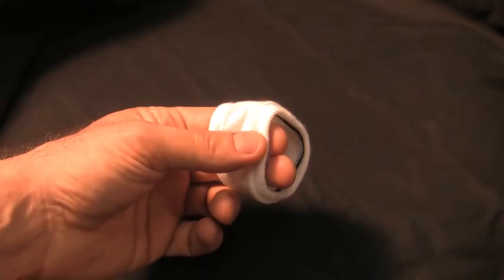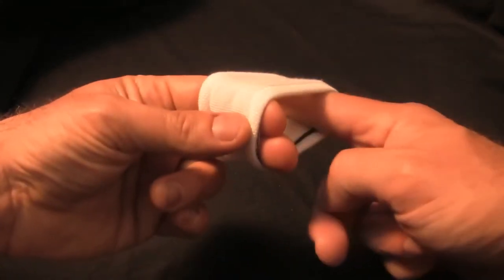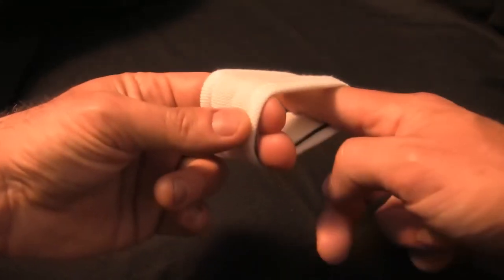When you first get your Snugs, or when it comes out of the dryer, it never hurts to give your Snugs a gentle stretch, especially if you have a large size mask.